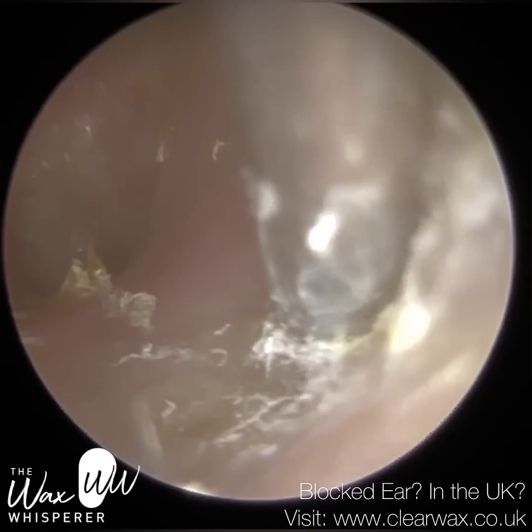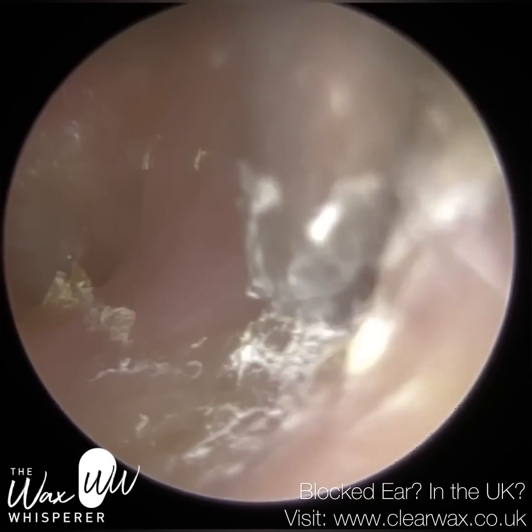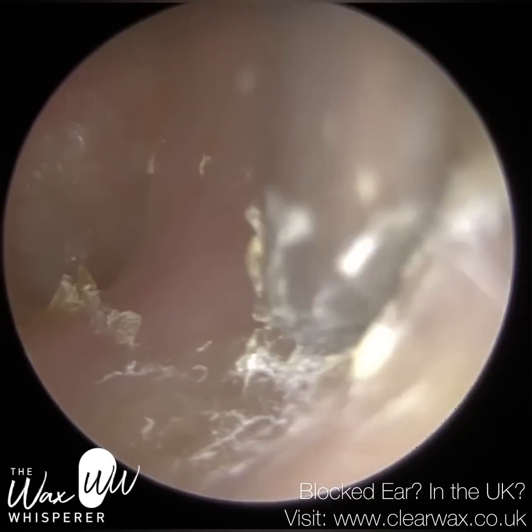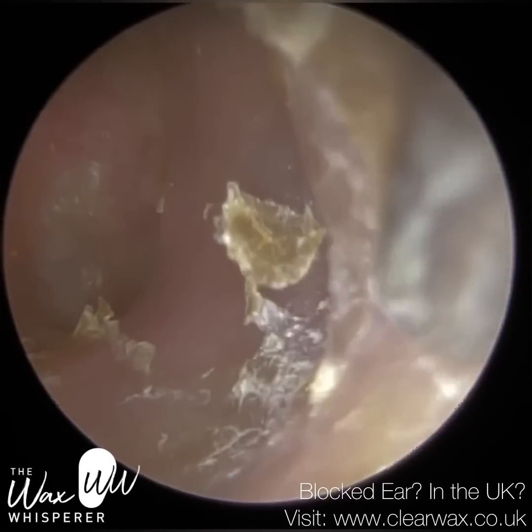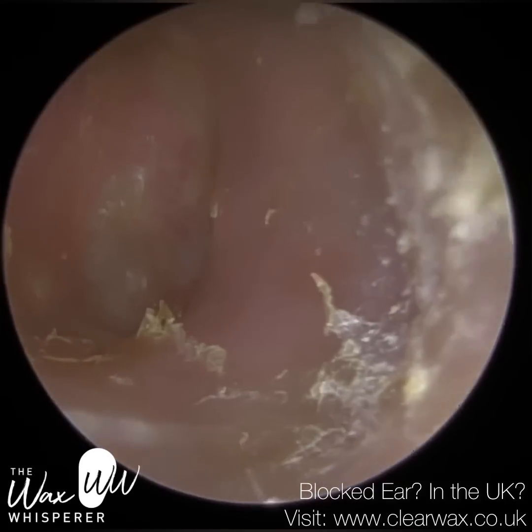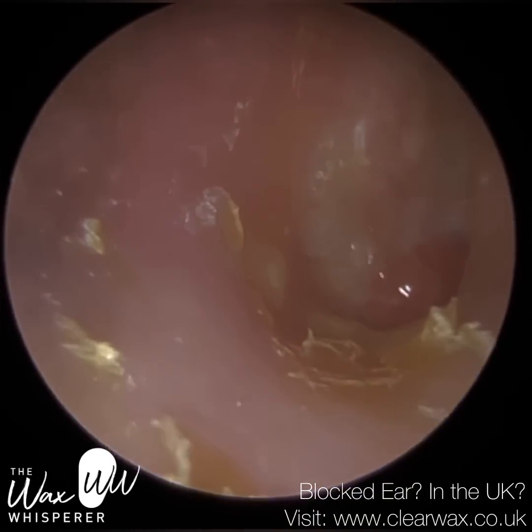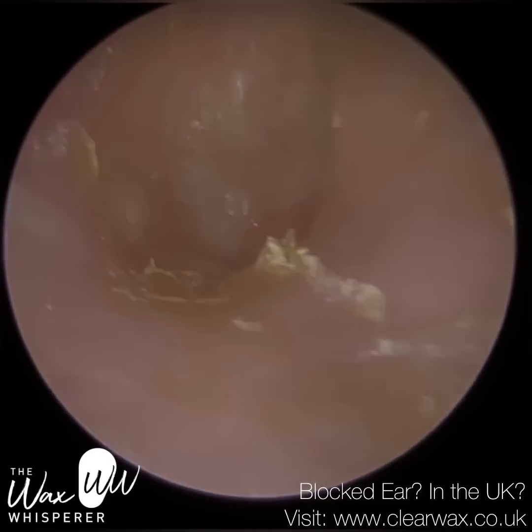It's really crystallizing. One of the patient's symptoms was itchiness in the ear, and no doubt that's not going to be helped by all this crusty dead skin. They felt the skin to be very tight in the ear, which of course, when you've got this thick layer of crystallized skin lining the ear canal, when you move your jaw and your ear moves, you can feel that.